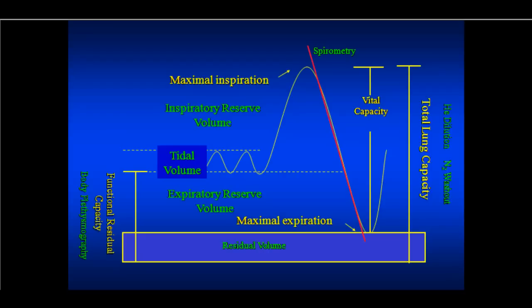I'm going to briefly describe each of these to you. All right, we want to get the total lung capacity. We can do it by helium dilution. I have a picture of that. We can do it by nitrogen washout. These are the dilution techniques.